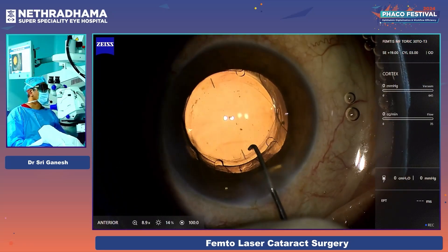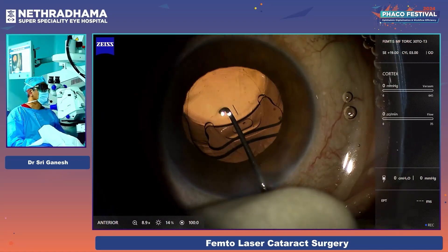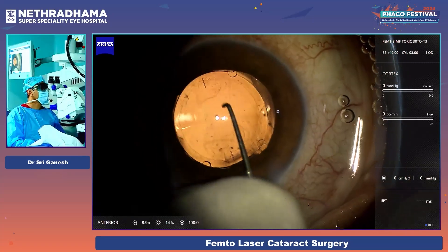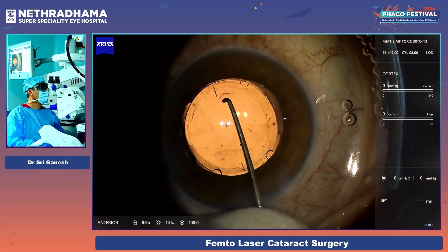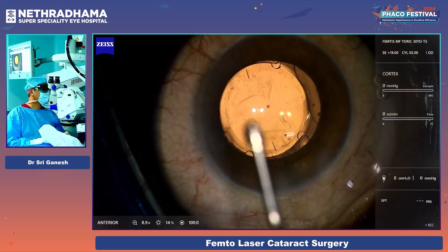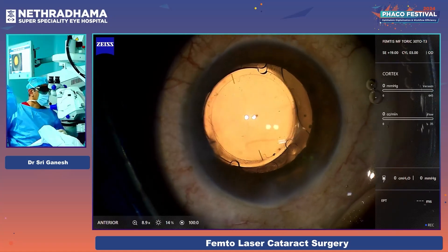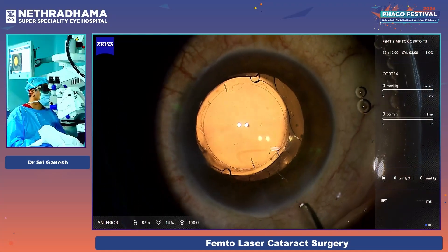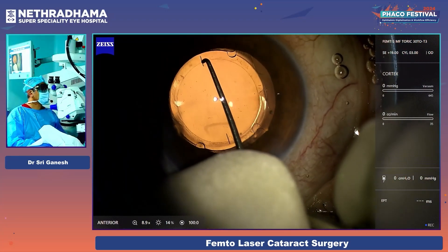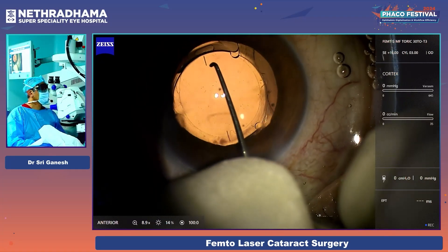Now I have to put this haptic in the bag. There it goes. I orient it correctly so that it is on axis, and then I have to enclavate it. Before I enclavate it, I put more viscoelastic — so there is no visco underneath the lens. Now it is oriented well. I hold with the Sinski and then do the enclavation.